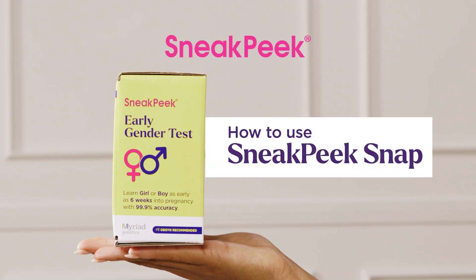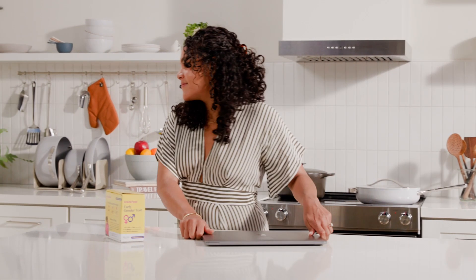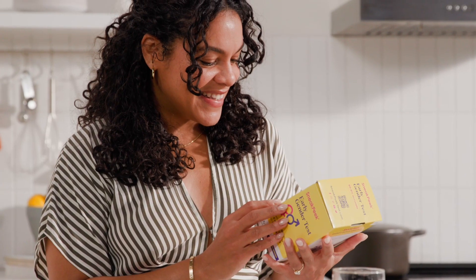Welcome to Sneak Peek, the earliest and most accurate way to learn your baby's gender. In this video, we'll show you how to take the Sneak Peek Snap DNA blood test to get the best results and reduce the chance of male DNA contamination.